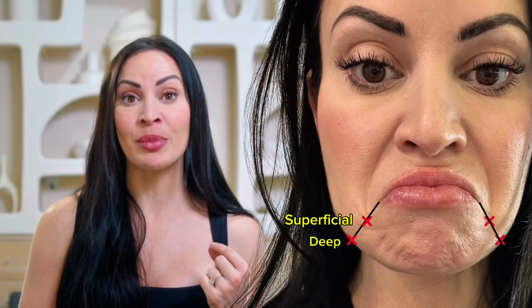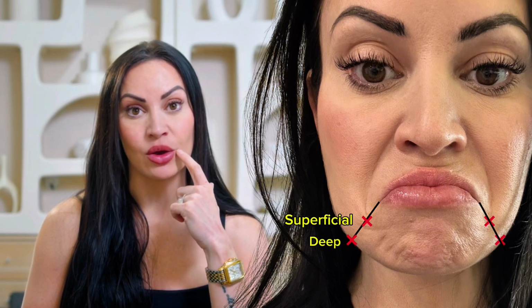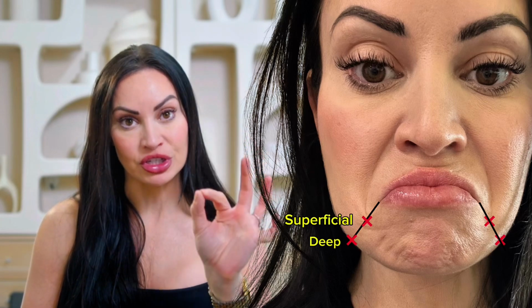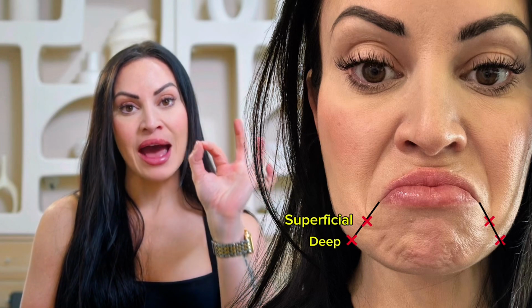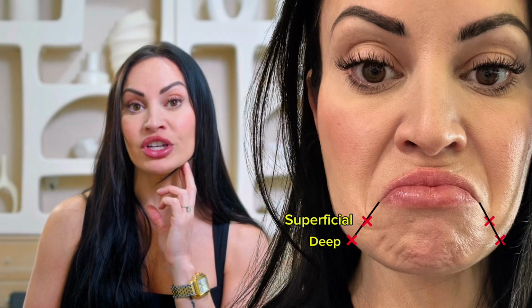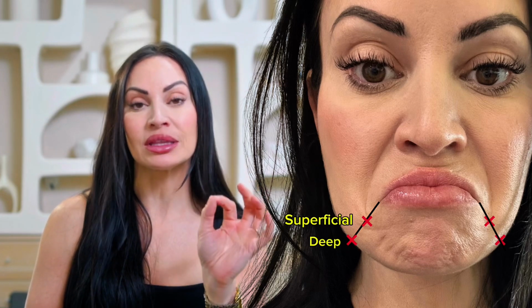So the way I inject the DAO, I have my patient frown. When I'm injecting the upper portion of the DAO closer to the oral commissure, my injection depth is superficial. I want to get just below the dermis where that muscle is. As I go lower towards the mandible, I'm a little deeper because it originates on bone. It originates at the mandible, so I can go a little deeper.